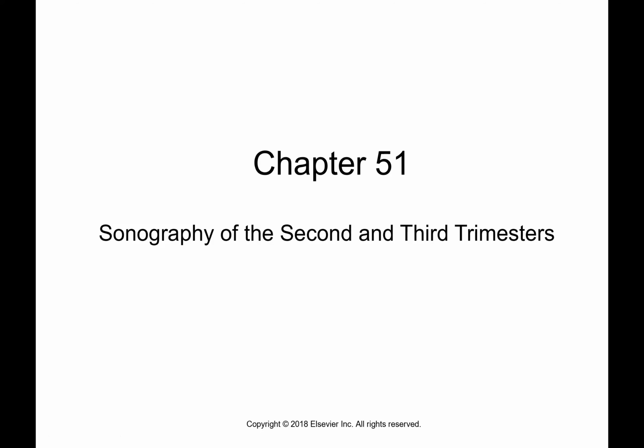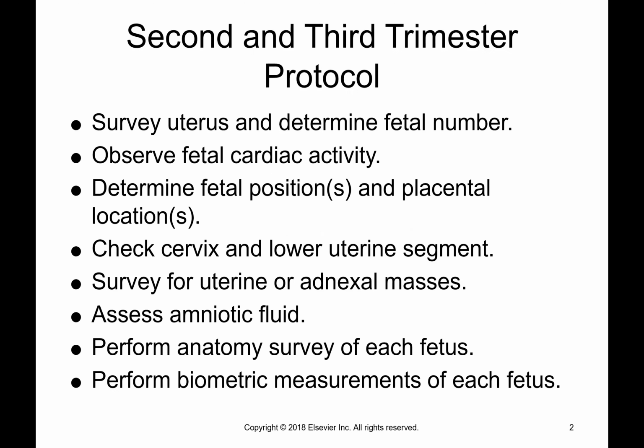I wanted to go over the most important things that I feel like you really need to know. You can go down a rabbit hole and get stuck and not get the generalized things that, as a young sonographer, you really need to know when you're scanning a baby. So I've tried to highlight that stuff for you in this chapter. I showed you our protocol, and this is basically the same thing, just going over another second, third trimester protocol, what we do.